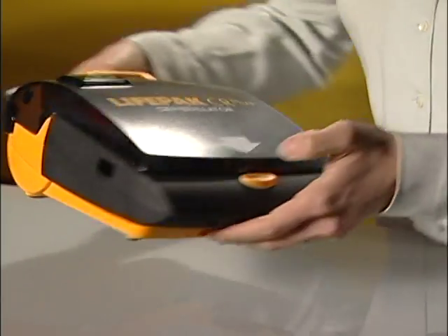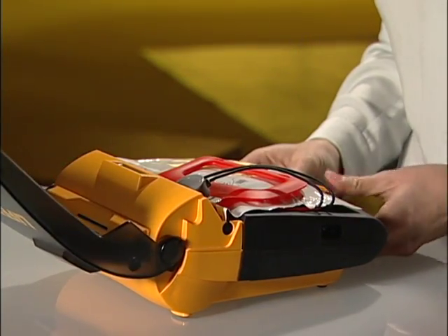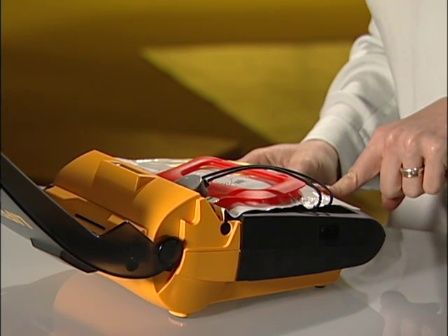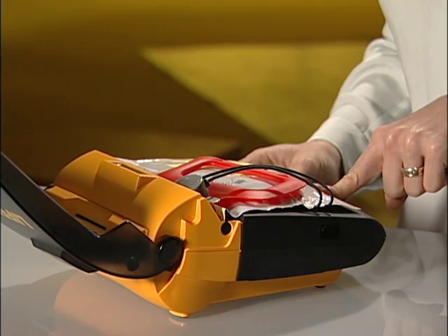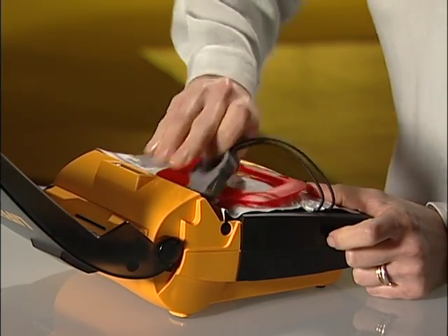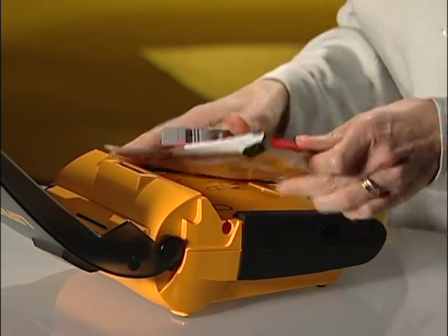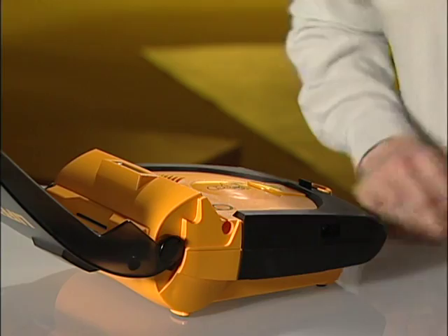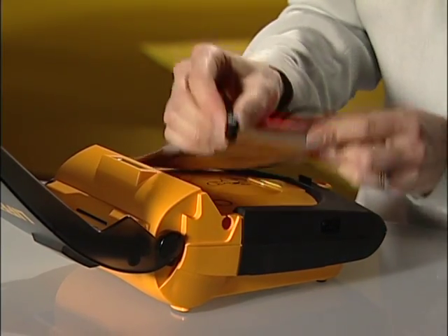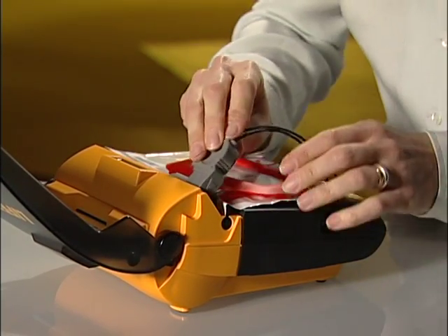Replacing the electrode packet is also easy. Open the lid. Call for help now. Hold down the on-off button to turn it off so you don't use up the battery. Now disconnect the electrode plug like this. Slide out this little pin here and throw away the old electrodes. Put the pin from the new electrode packet back into this same slot here. Plug the connector in.